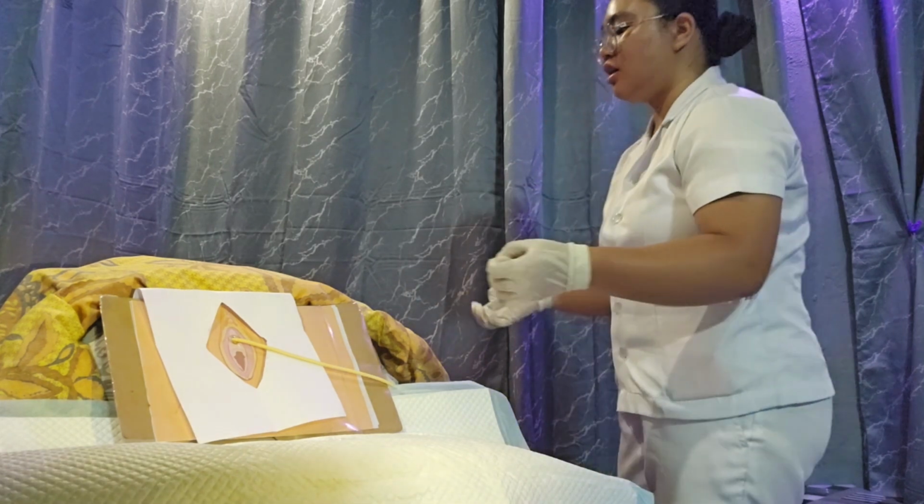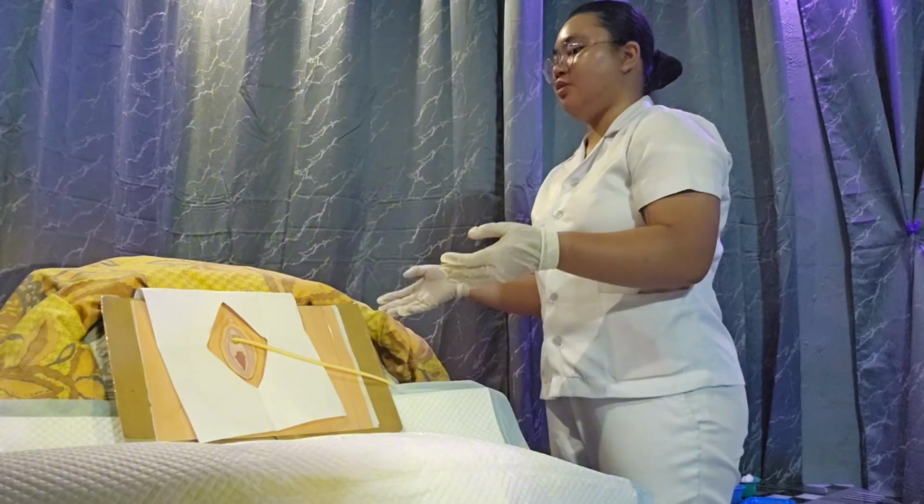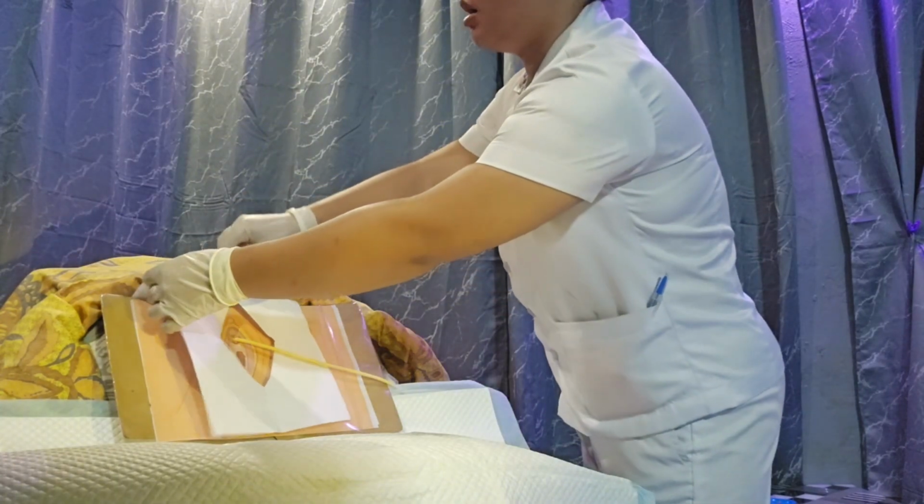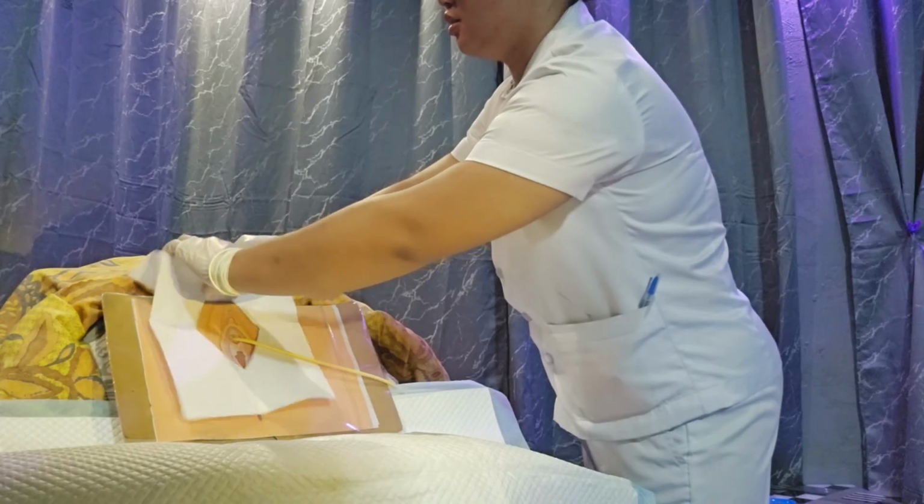So ma'am, I am now done with inserting po the catheter. So I am just going to remove this eye sheet po, okay?